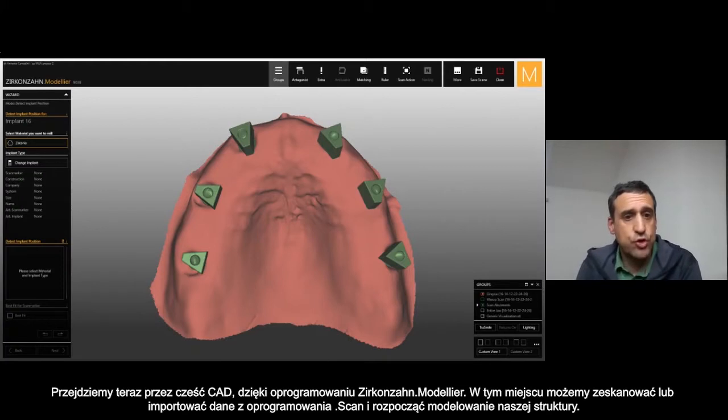We pass through the CAD software, through the modeler software. Starting from the scan or import of data inside the scan software, we can start to design our framework inside the modeler.